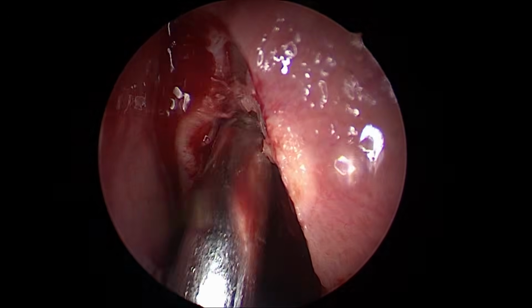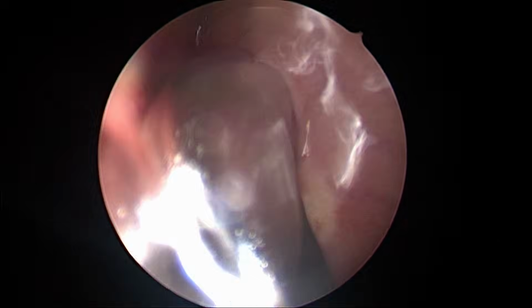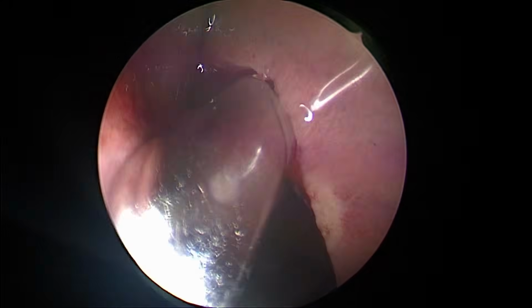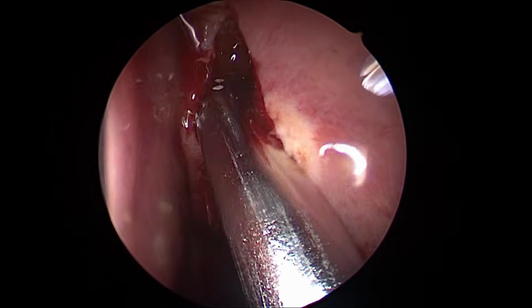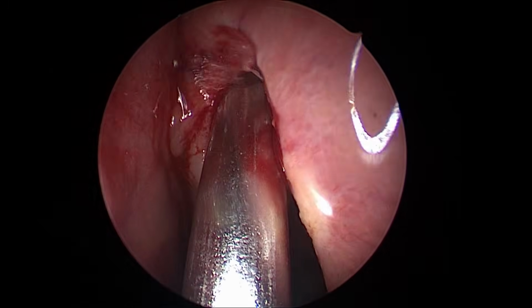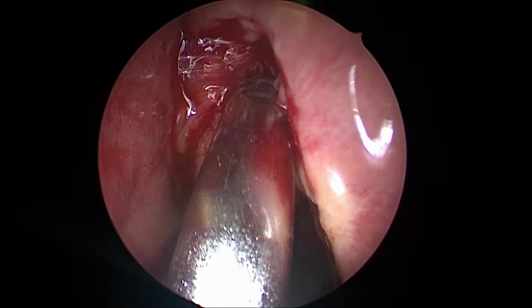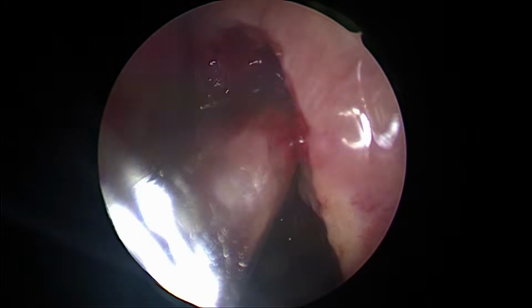Adequately open up the agger. See, this is the mistake people do. With 0 degree, I am more and more opening the agger high up. See this? Yes, sir. This is the key to reach the frontal. Adequately open up the agger. Adequate means fully open up.